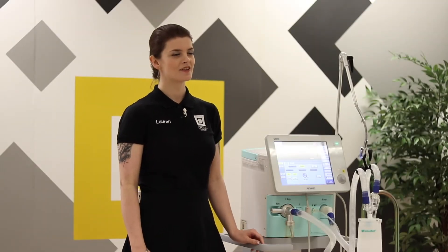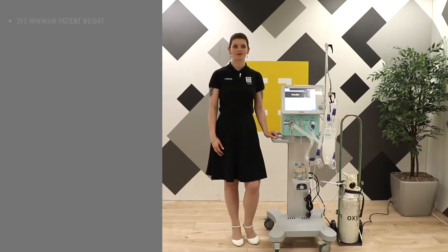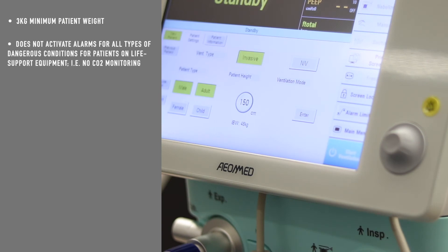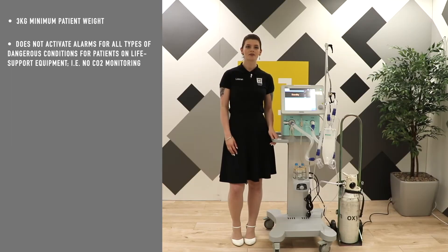Before using, there are some points to keep in mind. The minimum patient weight is three kilograms. The ventilator is not intended to be a comprehensive monitoring device and does not activate alarms for all types of dangerous conditions for patients on life support equipment. For example, there is no CO2 monitoring with the device, although this is an optional upgrade.